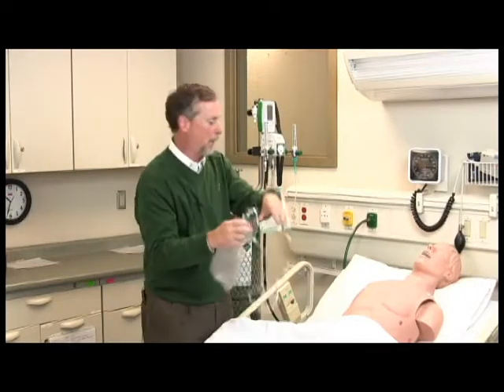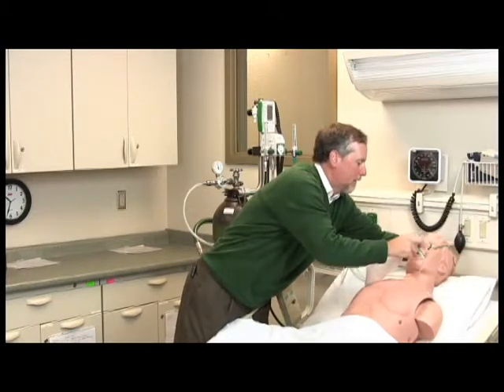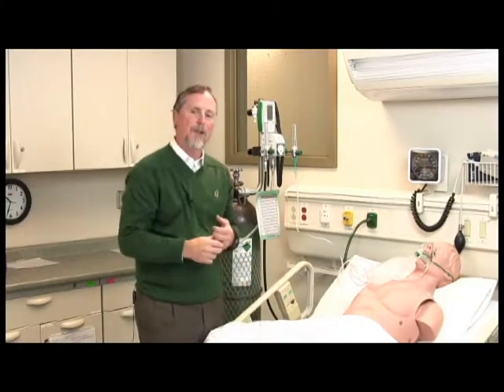So we fill up the non-rebreather, place the non-rebreather on the patient, and from there we can start monitoring the patient's breathing.